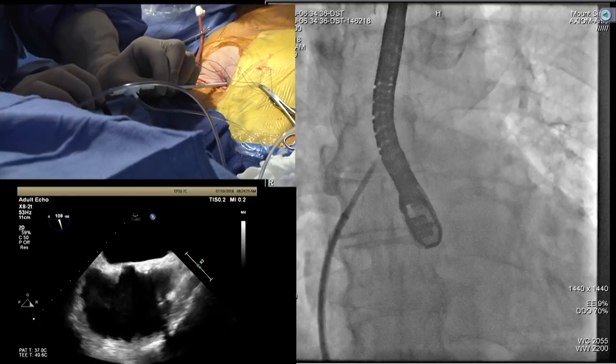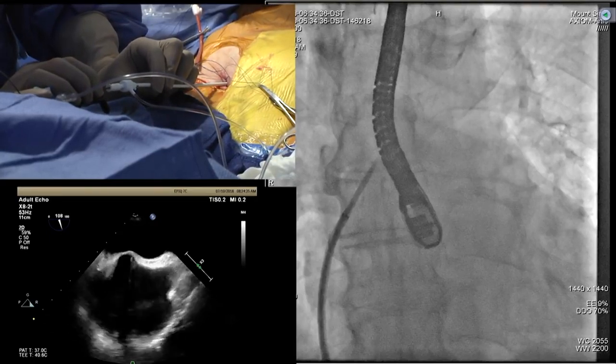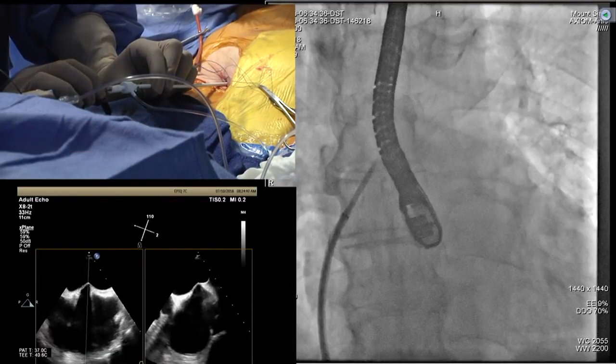It's a very thick septum with a small fossa. So you may see a small jump now. You feel it. Nice. Fluoro, please. So we predicted the jump. Now you see the tenting at this time.